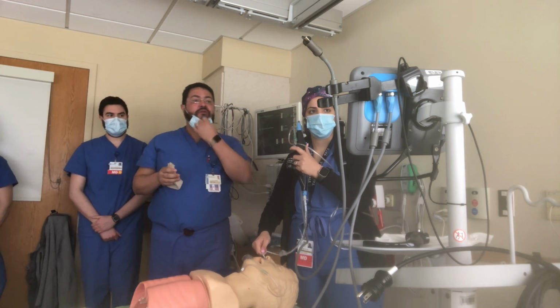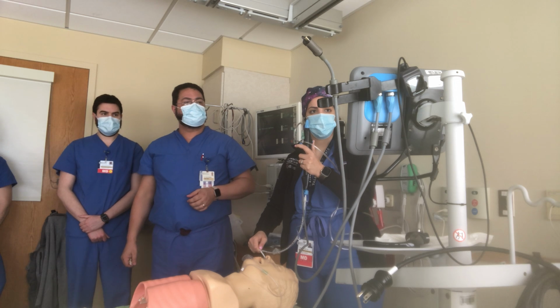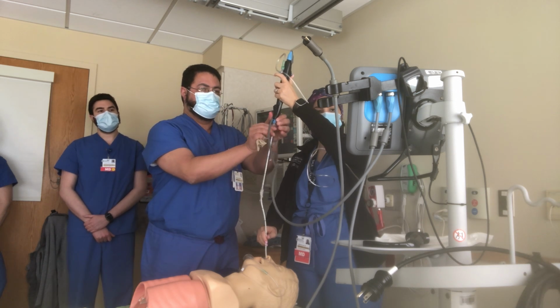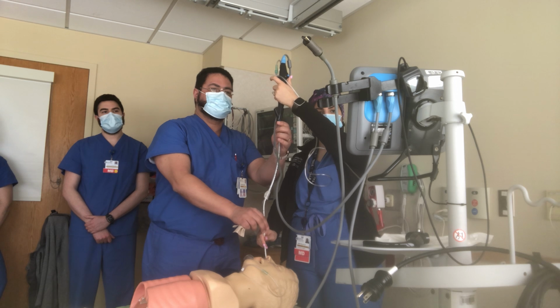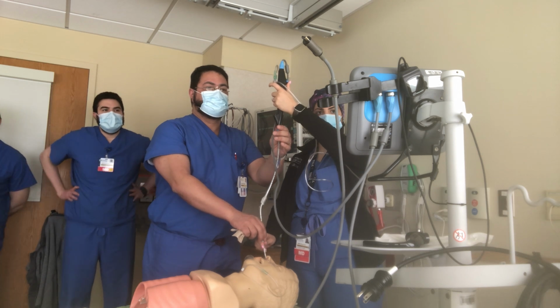All right, so where are you? So when you don't know where you are, you come out. No, see, the scope has to be top like this. All right, so we'll go. Oh, we're way up, so we're gonna go through it.